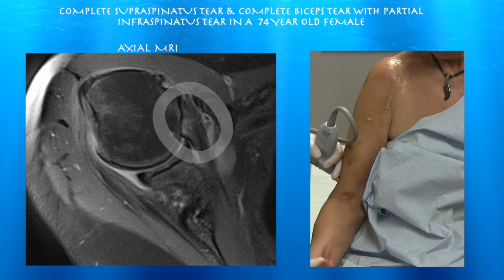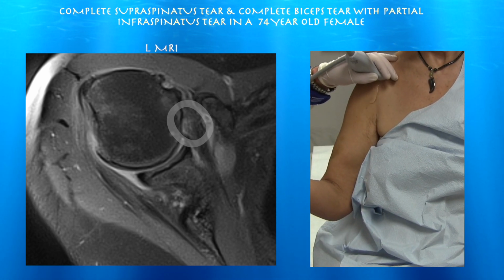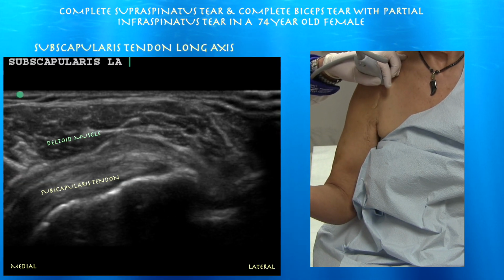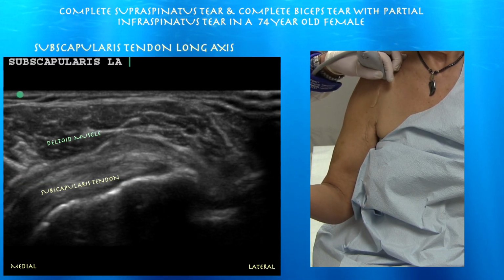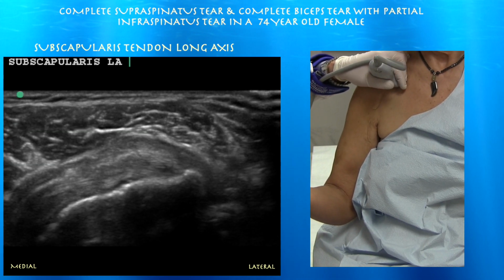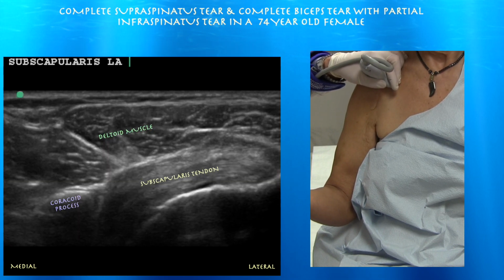Let's look at her subscapularis tendon. That I thought had perhaps an intermediate or high-grade partial tear. She's got fibers there attaching to the lesser tuberosity. Here's a fairly normal-looking subscapularis tendon. Left side of the screen is medial. You can see her coracoid.